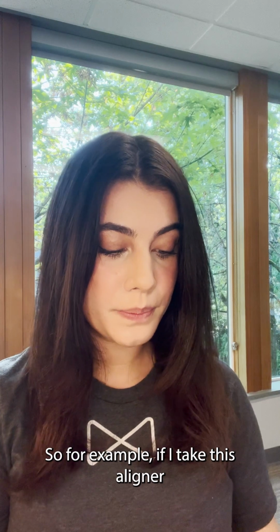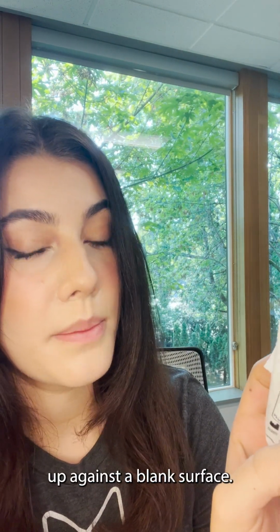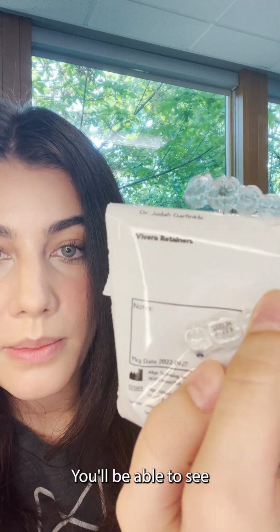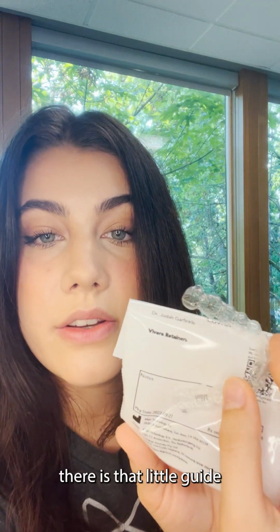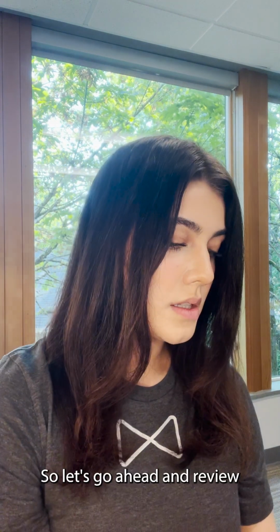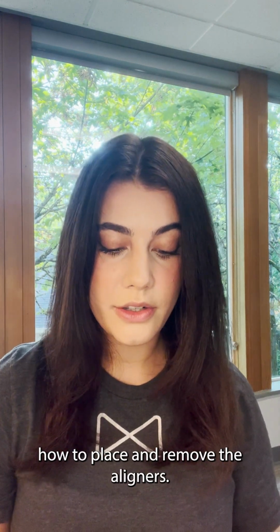So for example, if I take this aligner here, you'll just want to hold it up against a blank surface. So I'm just using the package here. You'll be able to see a little number on here. I know it's hard to tell in the camera, but it will have an L or a U standing for lower or upper, and then the number right next to it. So if you ever need it, there is that little guide on each aligner that tells you which number it is. So let's go ahead and review how to place and remove the aligners.